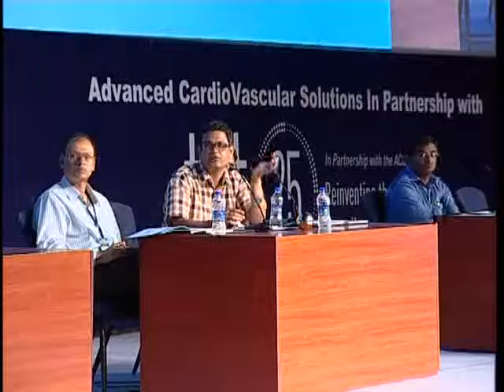It is a 7 mm stent, sir. No, what I'm trying to say is, whatever the stent, you will undersize it actually. That is the problem. I'm just bringing to your awareness that these are the issues when you have a thrombus, also in primary PCI. Once you put a stent, the important thing is to take an oversized stent and dilate at a lower pressure, rather than taking a right-sized stent and going at a higher pressure. That is what is recommended. Same for SVG grafts, where you have a lot of cheesy material. These are the strategies one would advocate for overcoming these problems, or put a self-expanding stent.